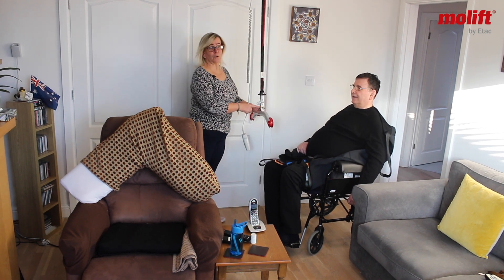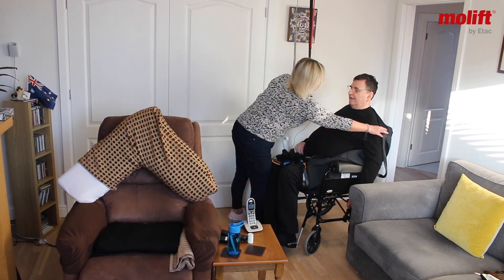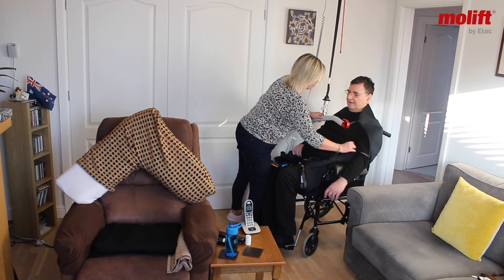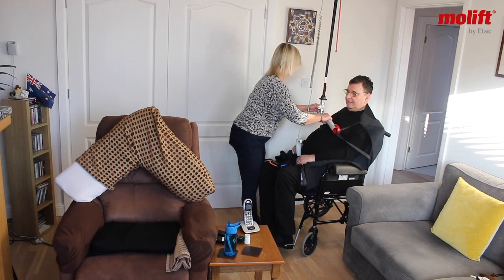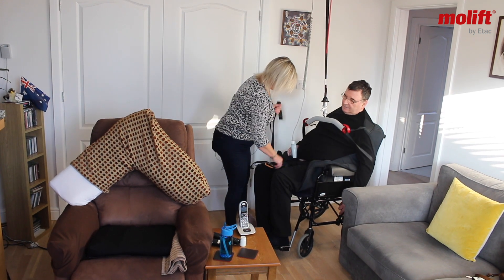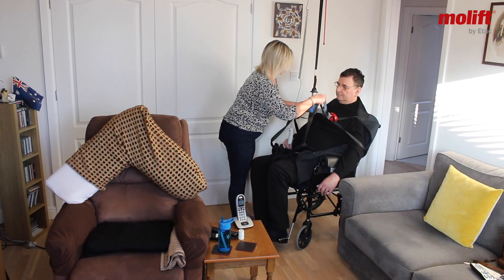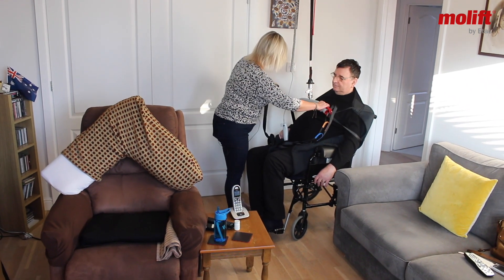I'm going to bring the hoist over to Philip and hook his hoist up onto the bar. For the top we always use black straps because that's all there is. And then to suit Philip we use the grey straps, and that will keep him in a more sitting position when he's transferred.